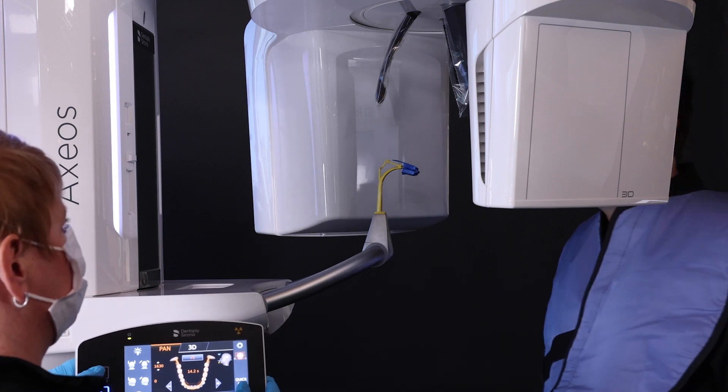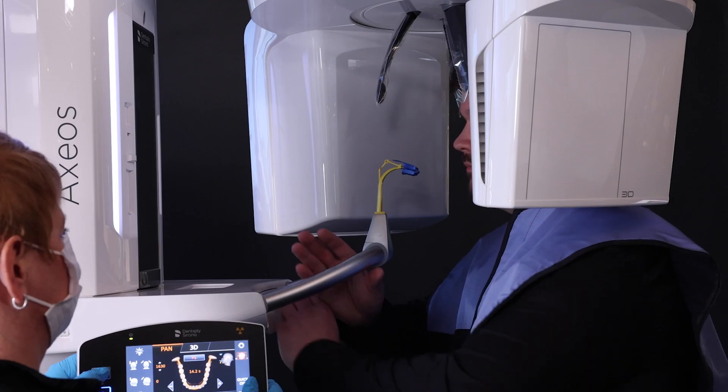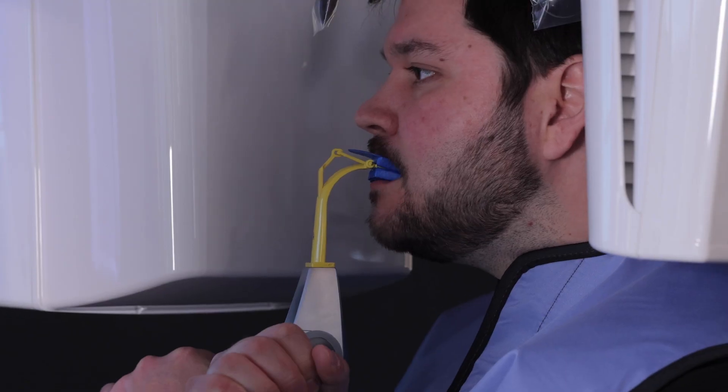Invite the patient to enter the machine and grab the handles appropriately. Have the patient take a half step forward to straighten the spine. Instruct the patient to bite correctly on the blue foam.